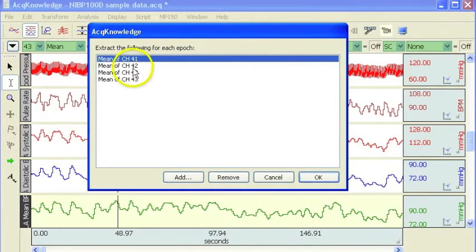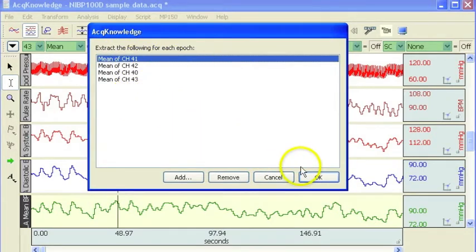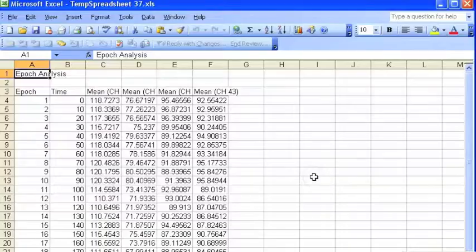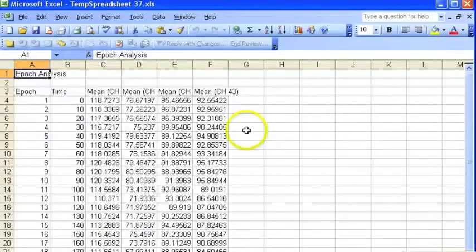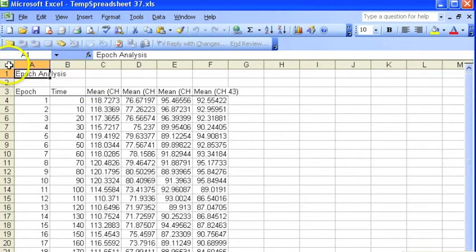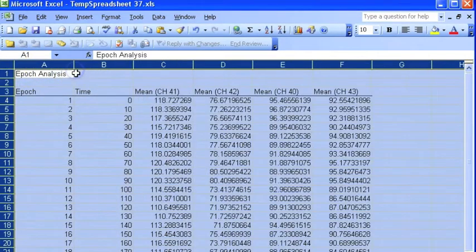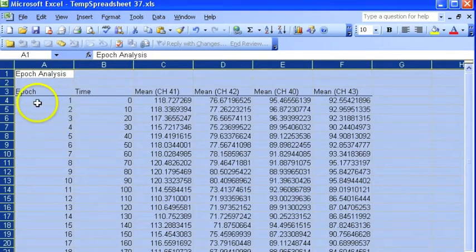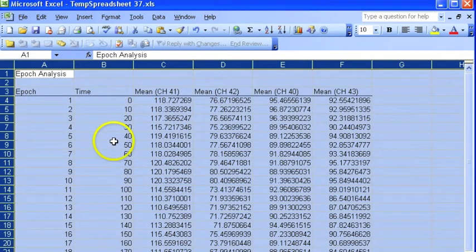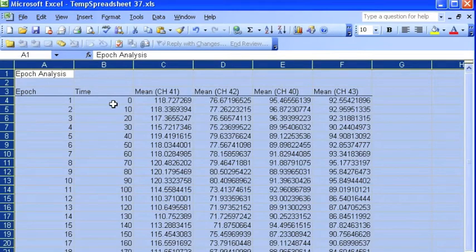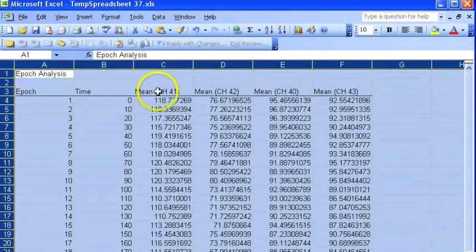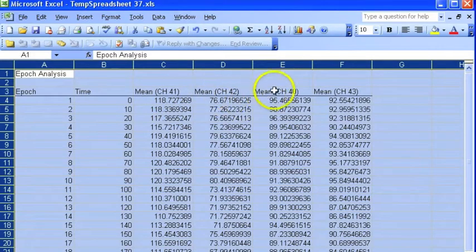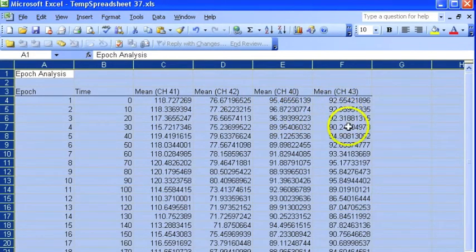So now we've got four different measurements selected on four different channels. Select OK. The software has gone through, it's analyzed the data. There's the Epoch number, the time, the measurement started, and then the values for mean systolic, diastolic heart rate, and mean blood pressure.